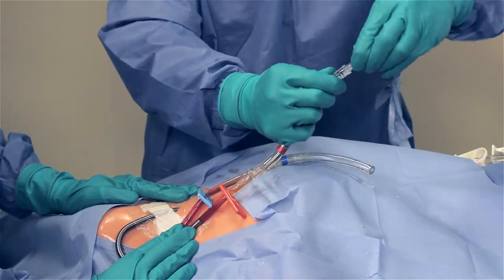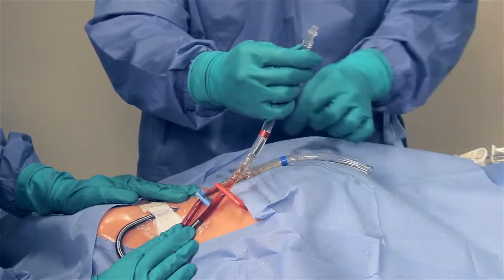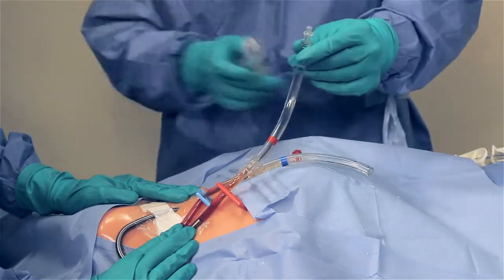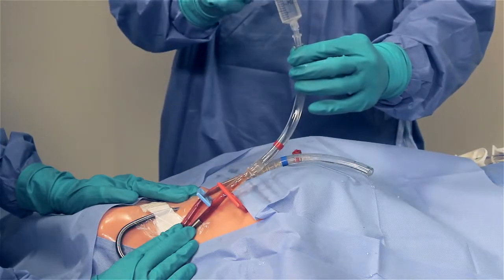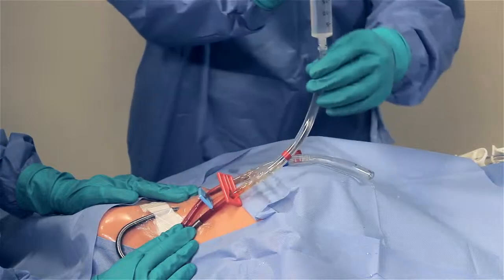Insert a luer adapter located in the rinse back kit into the red and blue tubing located at the end of the catheter barbs. Use the luer adapters to flush the catheter while changing out the cartridge to prevent the catheter from thrombosis.